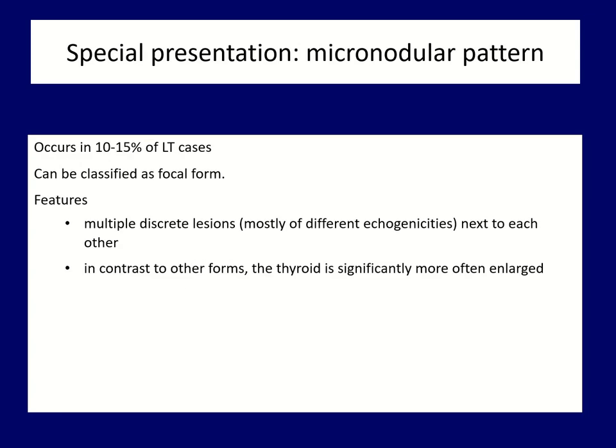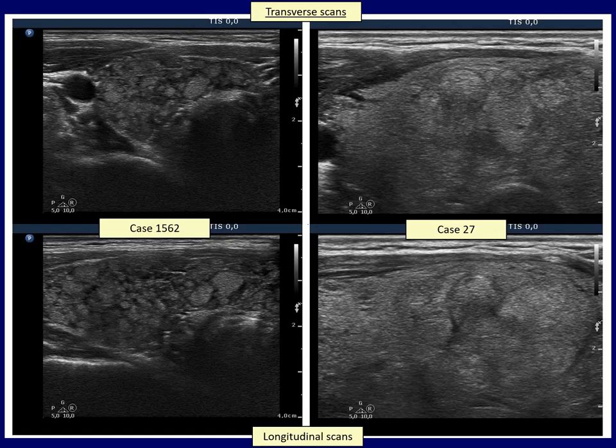The second special form is the so-called micronodular or pseudolobular form of lymphocytic thyroiditis. These micronodules resemble the former; however, the discrete lesions are larger, ranging from several millimeters to one to two centimeters. The discrete lesions frequently differ in echogenicity, but the echonormal or hyperechoic form is more frequent compared with the usual focal form or the honeycombing pattern. In contrast to most cases of lymphocytic thyroiditis, the thyroid is usually enlarged. In the left example, the thyroid is normal-sized with numerous echonormal areas in a hypoechoic background. The right case shows an enlarged thyroid where only the lower two-thirds is composed of discrete lesions.